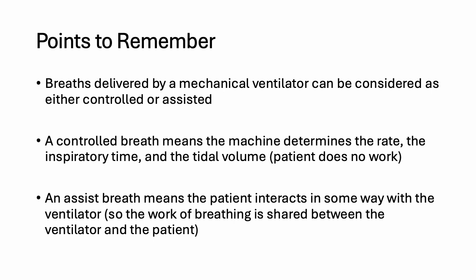But I stress again, you need to know the difference between machine breaths and spontaneous breaths because it determines what you can do with the patient. For example, if a patient is only receiving controlled or assisted breaths, which means all breaths are machine breaths and controlled by the settings, then if you ask the patient to do deep breathing exercises, even though the patient is awake and can follow instructions and commands, it just doesn't work. Because if the machine is set to deliver 500 milliliters, no matter how hard the patient is trying to take deeper breaths, the machine will only deliver the 500 milliliters, and therefore the patient will only receive 500 milliliters.